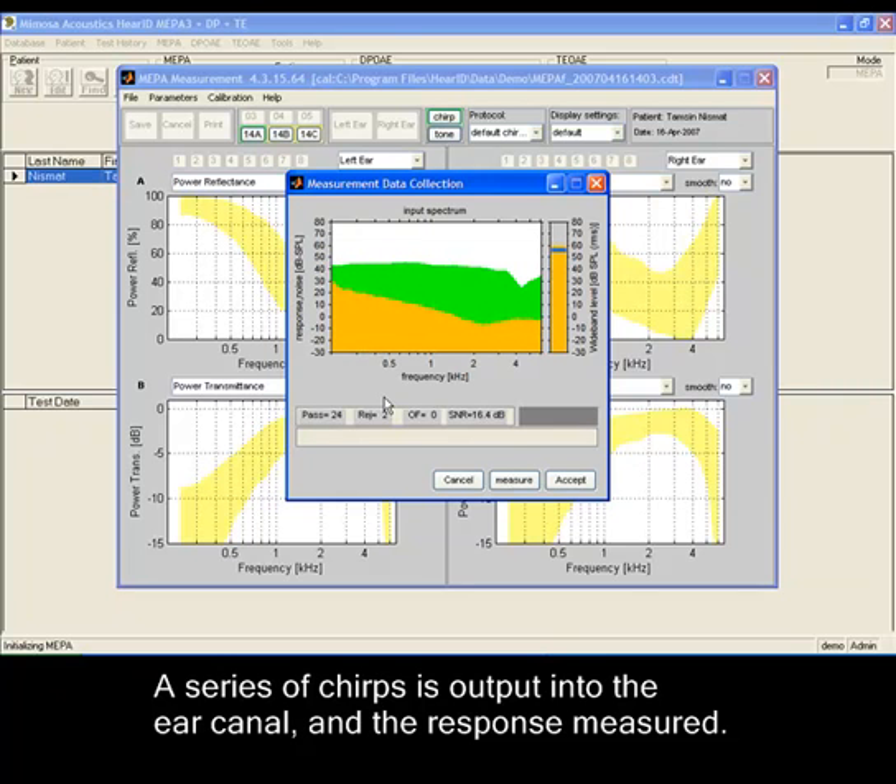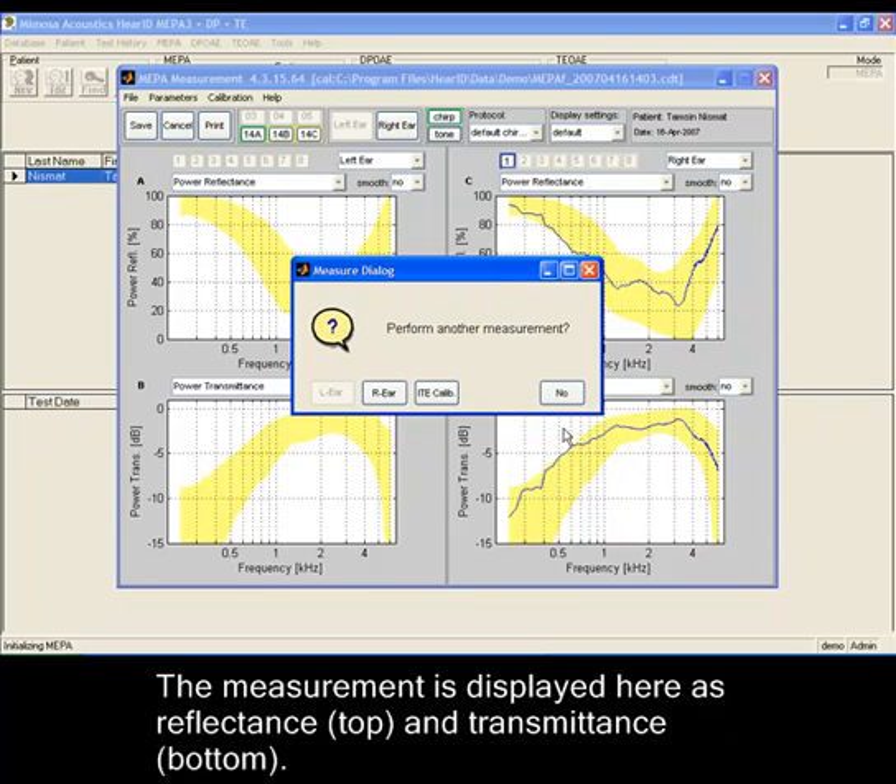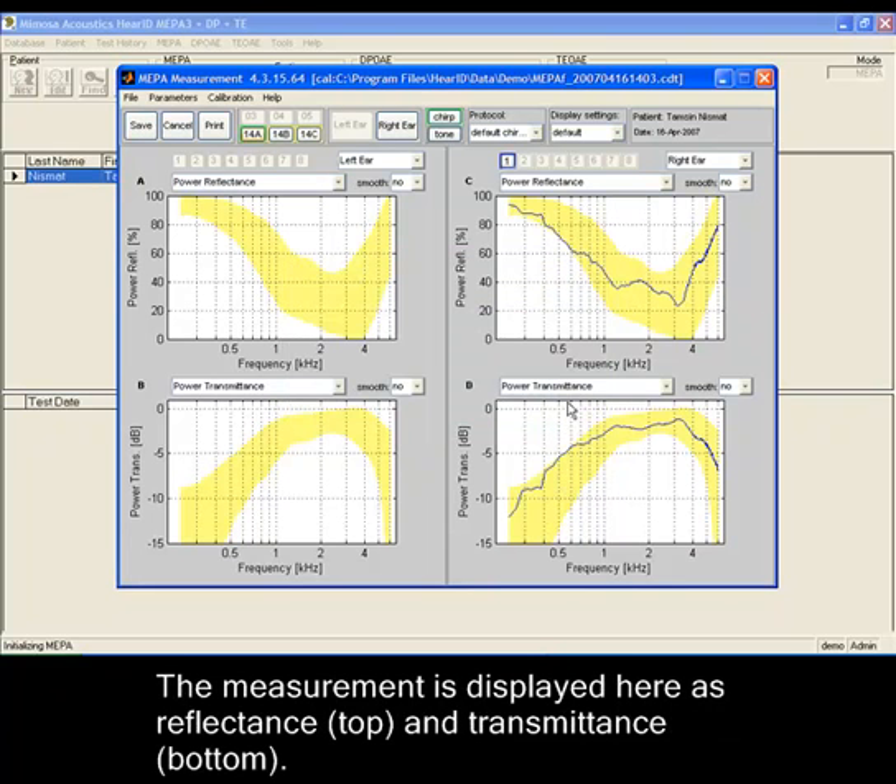A series of chirps is output into the ear canal and the response is measured. The measurement is displayed as reflectance and transmittance.